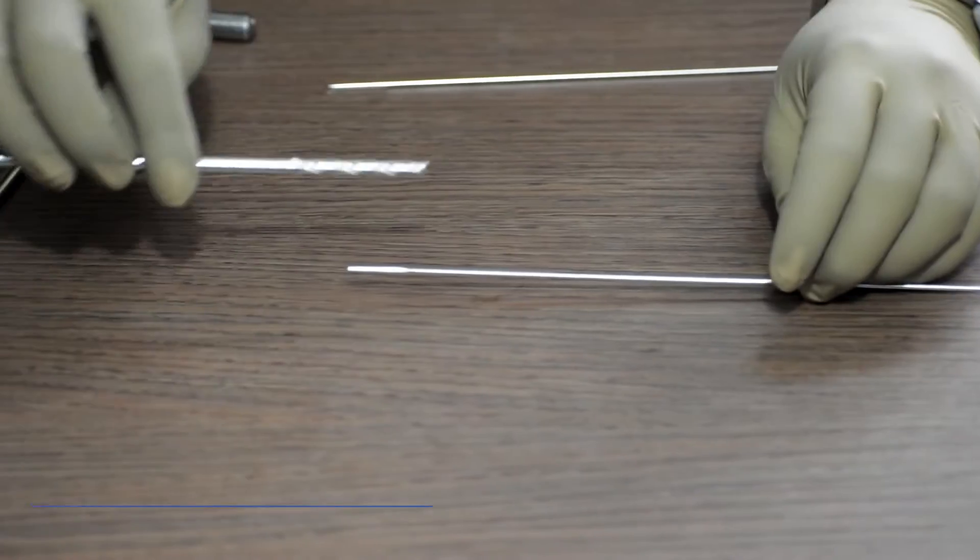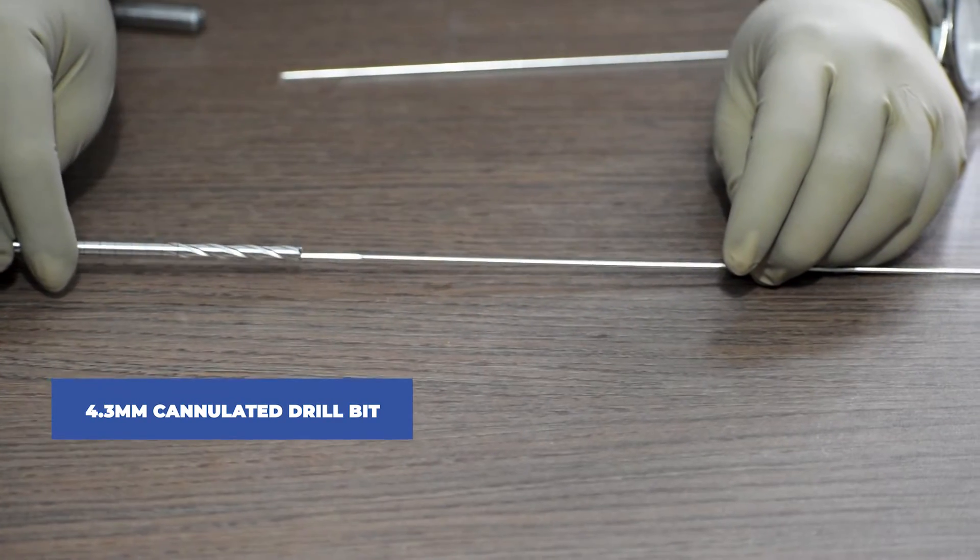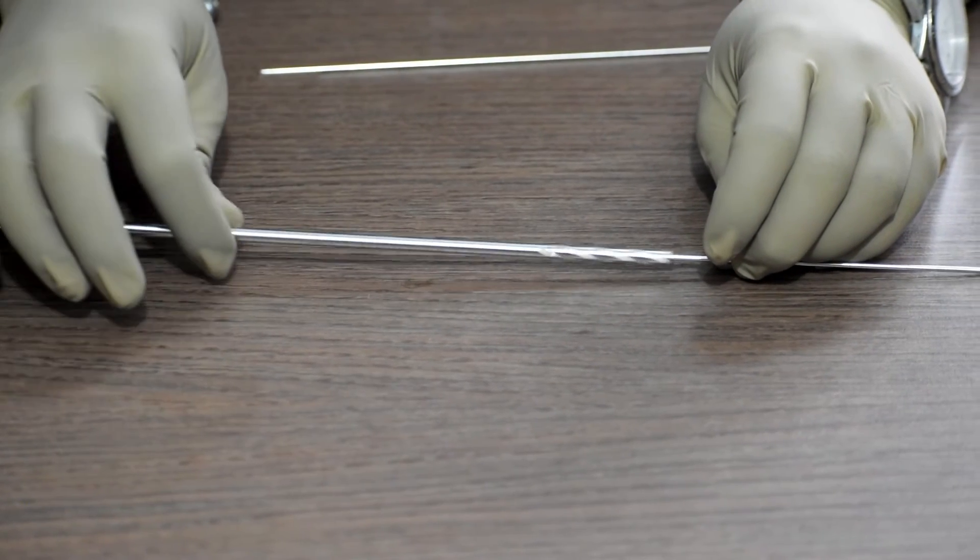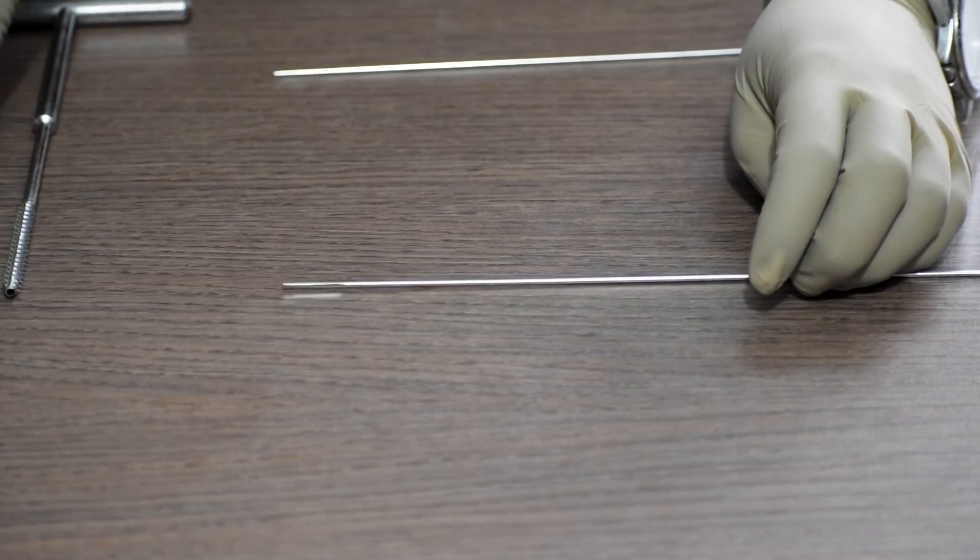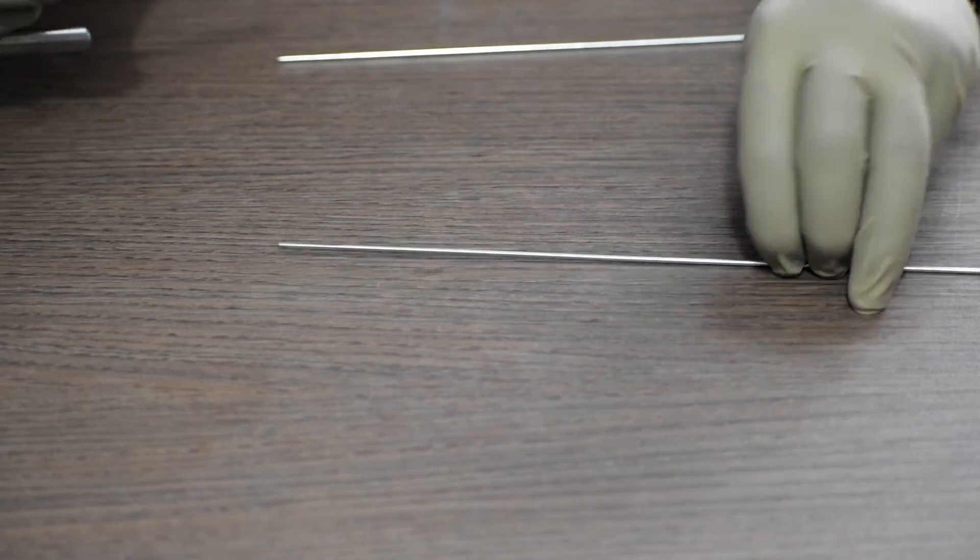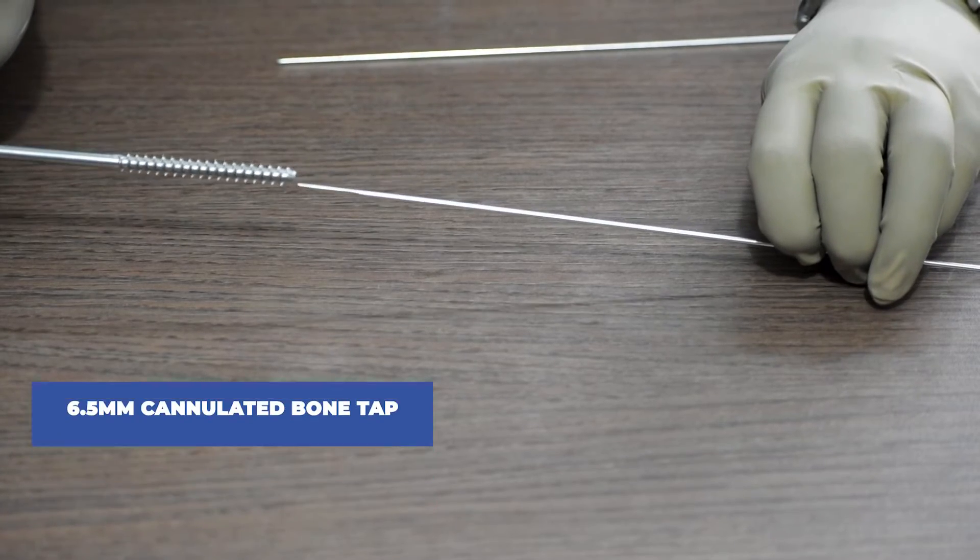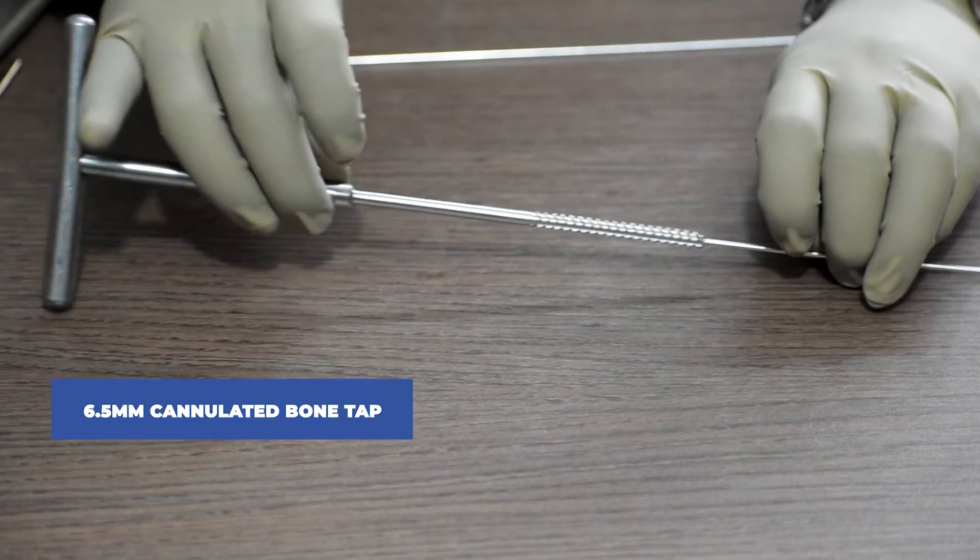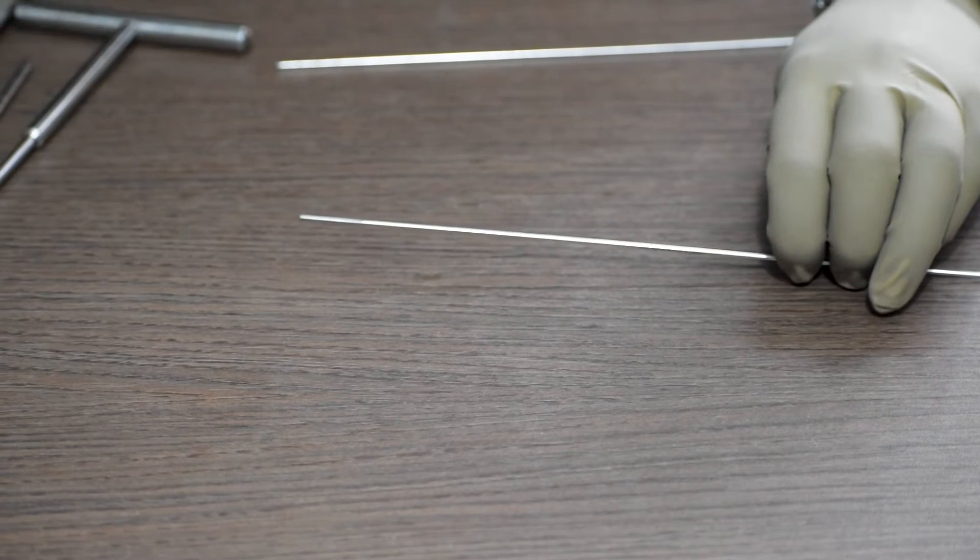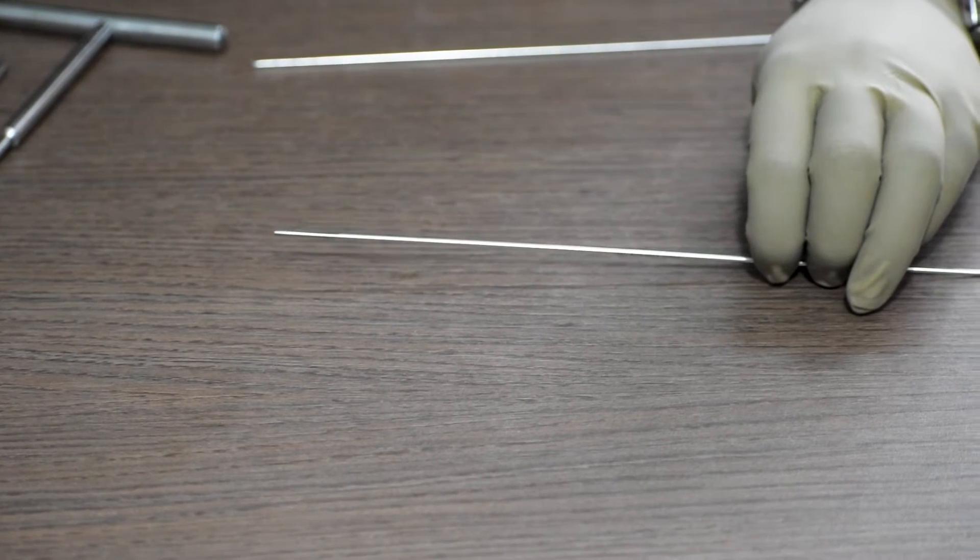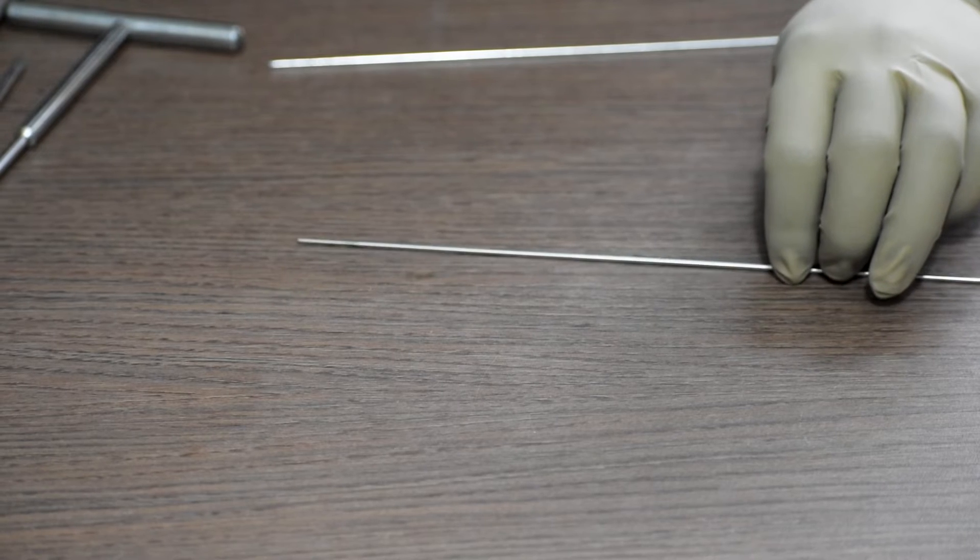Then, we will drill with a 4.3mm cannulated drill bit. Then, we will tap with a 6.5mm cannulated bone tap. In each of these cases, this guide pin or guide wire will pass through the hollow cannulated region of each equipment.